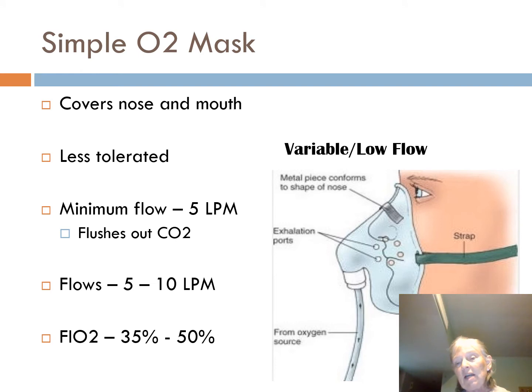It has a different type of strap, okay? These straps are pretty good, except if you don't have any hair, or if you sometimes have a lot of hair, it'll start to slide down, and we'll start to see these masks coming down a little bit. There's a little metal piece over the top. You want to conform it to the nose, just squeeze it a little bit, but you have to keep these out of the patient's eyes, otherwise it's extremely annoying.